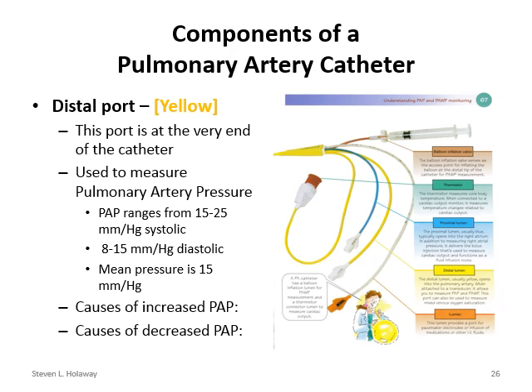Pulmonary artery pressures range from 15 to 25 millimeters of mercury systolic to 8 to 15 millimeters of diastolic. The mean arterial pressure is usually somewhere around 15 millimeters of mercury. And many times what they're monitoring, like in CVICU, is that mean pressure. They're trying to maintain that mean pressure kind of in the mid-range there.